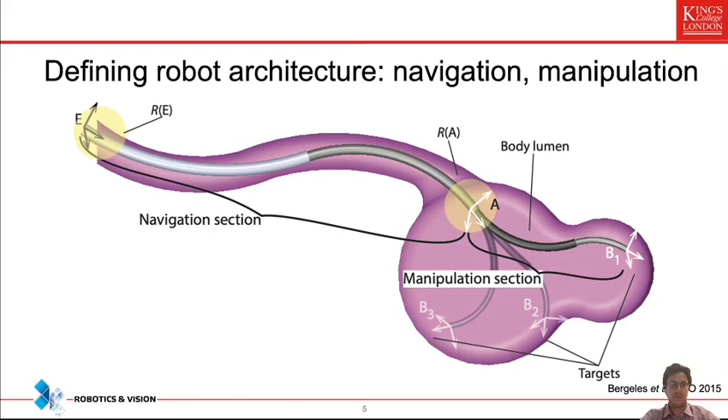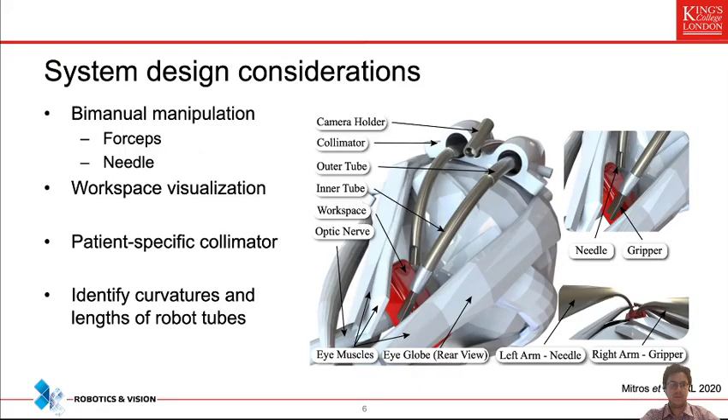We looked at the clinical requirements to gather system design considerations. First, we must have a bimanual manipulation system — one forceps to hold the optic nerve in place and a needle to perform the fenestration. We also need to visualize the workspace, using a 1.1 millimeter camera from Enablement with embedded illumination. The workspace the robot must reach is indicated by a red rectangle, and the robot should cover this space with good overlap between the left and right manipulators. A good camera orientation also requires manipulation of a third arm carrying the camera.